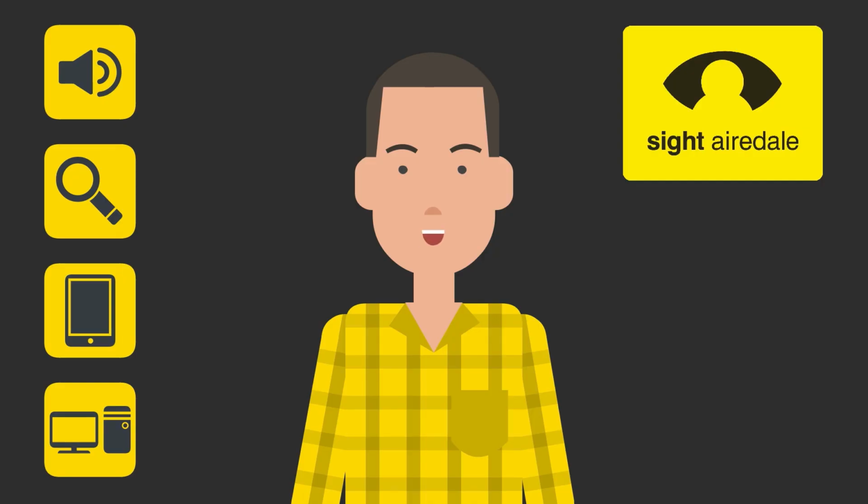I then tried this on our 65-inch display in the meeting room. I stood about 2 meters away from the display, and this time the OrCam struggled. I think the main problem was aiming the laser lines, because the brightness of the screen made the laser lines disappear.